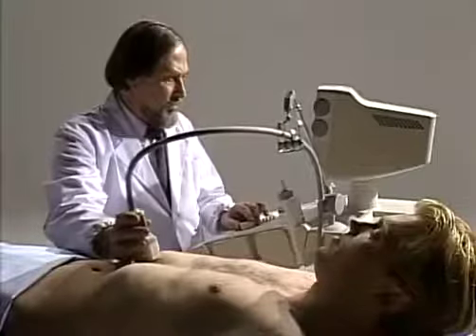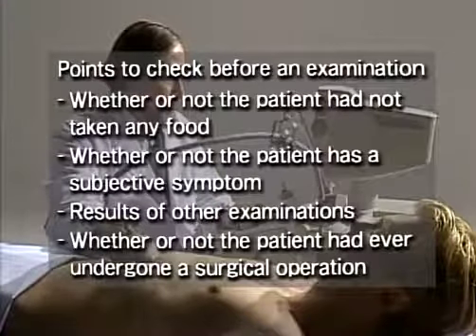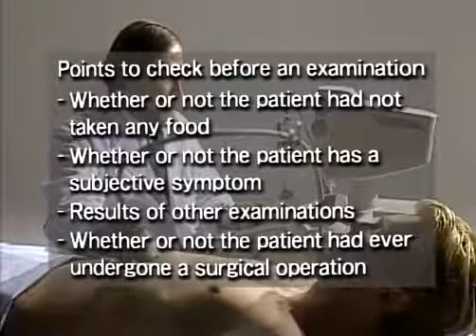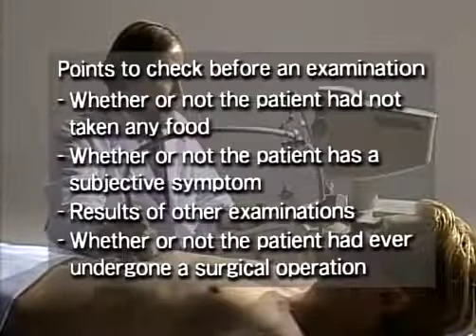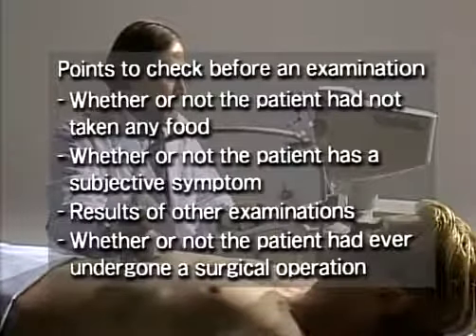Now, let's start the examination, but before that, we must ask the patient some questions. First of all, confirm that the patient is in fasting condition. Check if the patient experiences any subjective symptoms, and also if the patient has previously undergone an examination or a surgical operation.